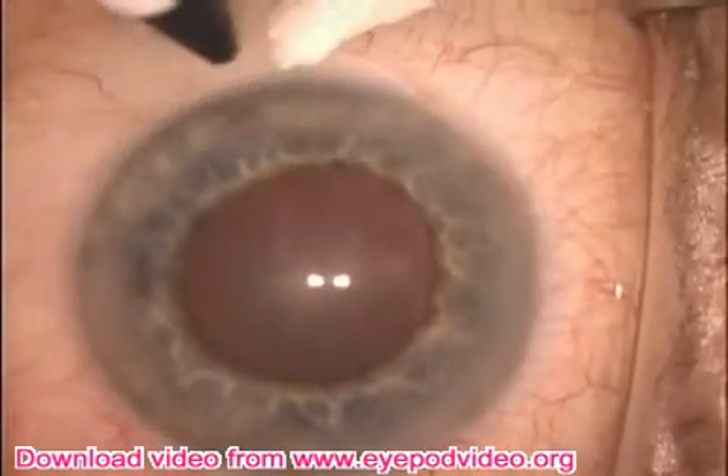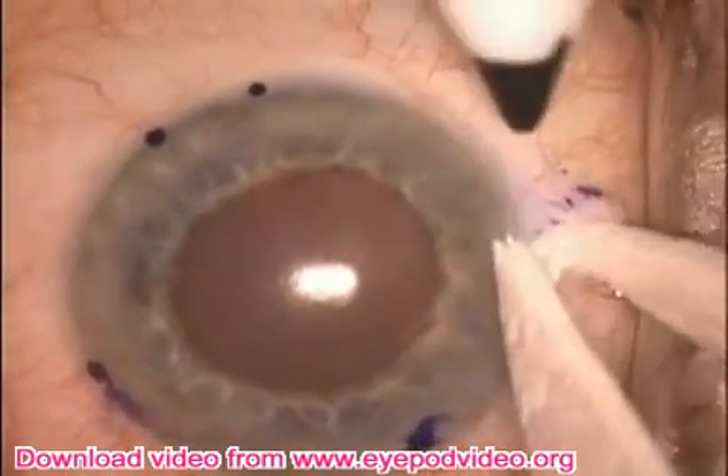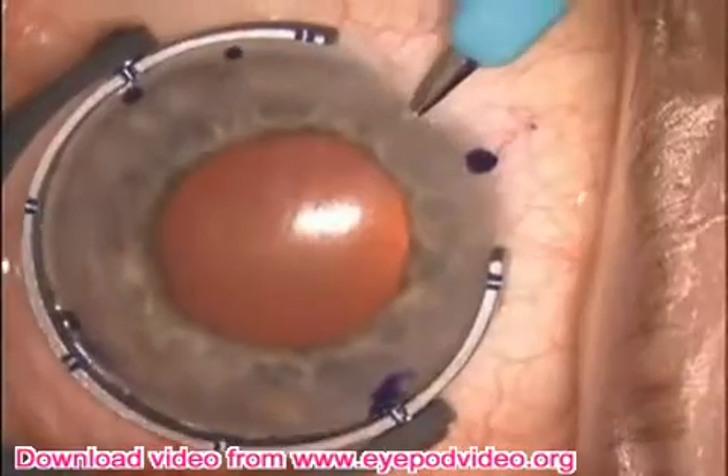Here we're planning for placement of iris retractor hooks. Two dots are placed where the incision will be made, and then one dot for each of the four hooks.